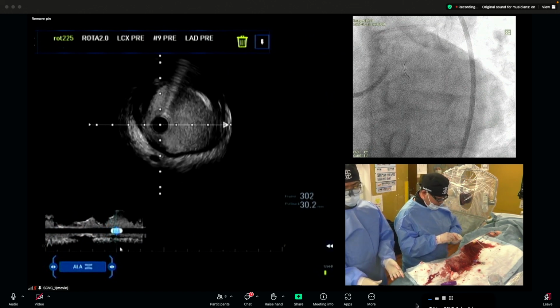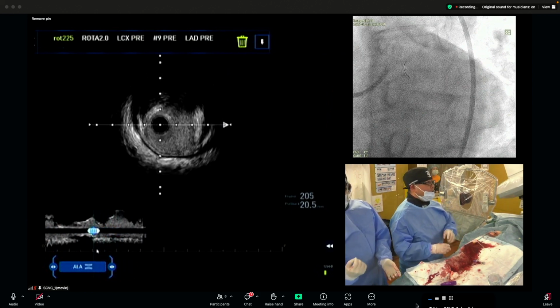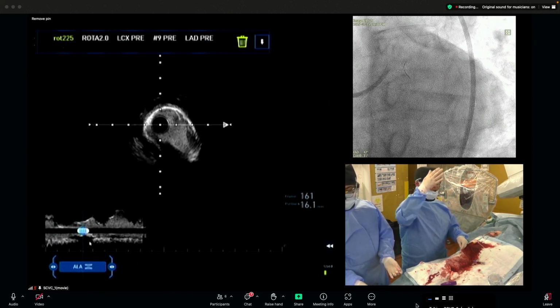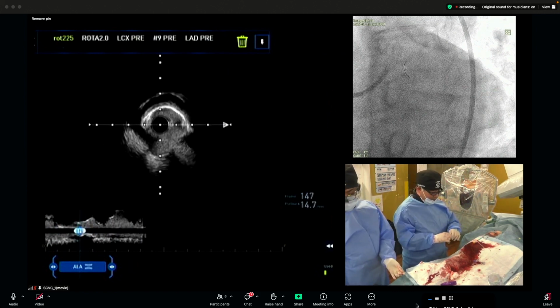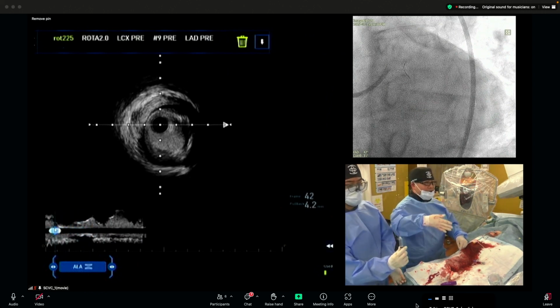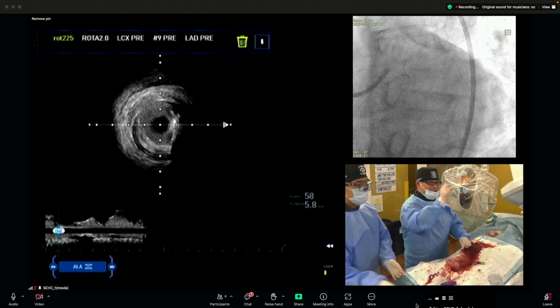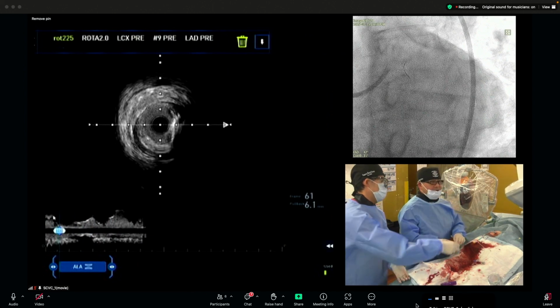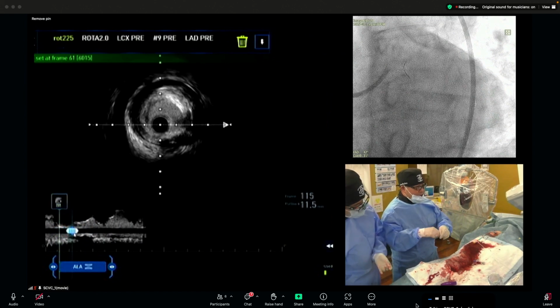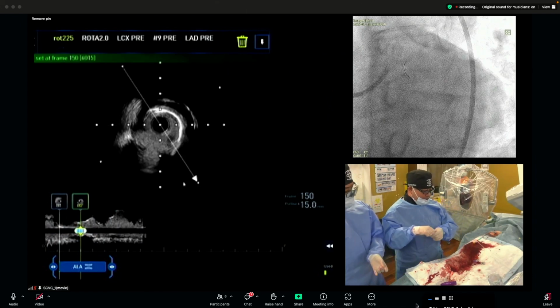I don't think so, because I always perform the same rotablation in any situation. I set a BA ratio of 0.5 or more for the bar size, and of course a rotational speed of more than 180,000 as fast. Then gentle manipulation always, because we need to support the differential cutting mechanism and follow the bar vector as the same as the distal vessel vector.